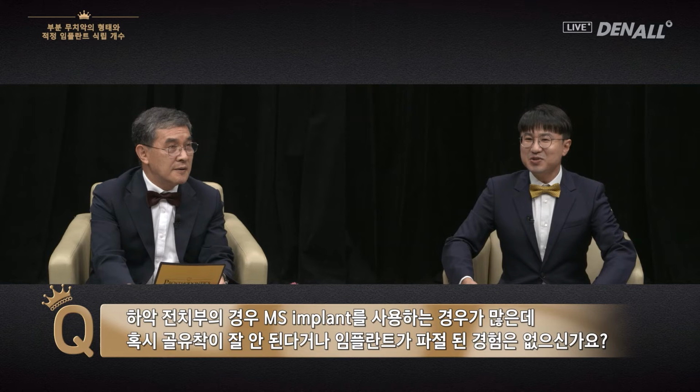Labiolingually, there's not a lot of bone width. A lot of people place MS. I believe most of the people use MS. MS is one body and the diameter is thin. And therefore, the area for osseointegration is limited. As you use MS clinically, is there any difficulty that you have experienced? Did you experience any failure? Or did an MS implant fracture? Or any other problems?